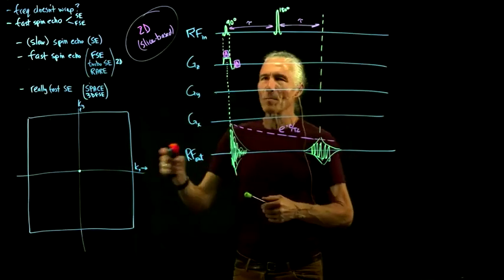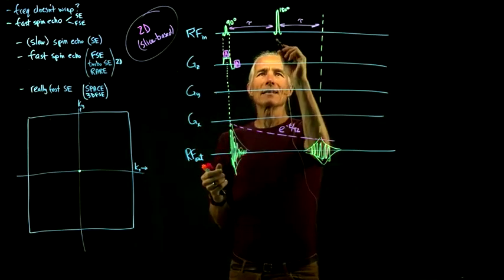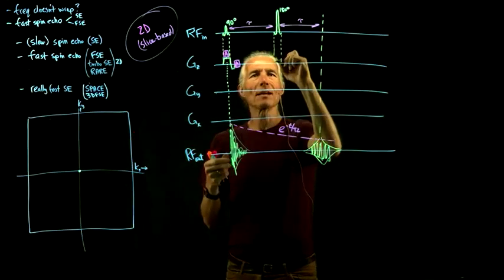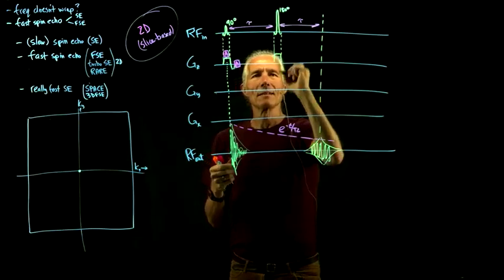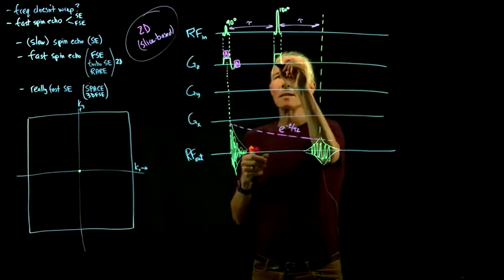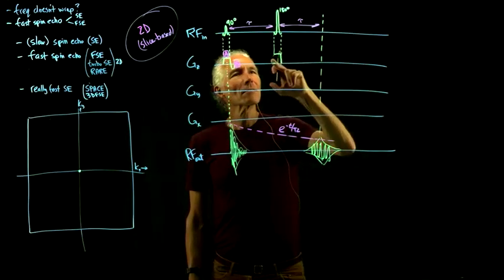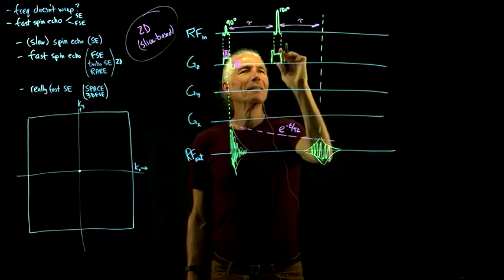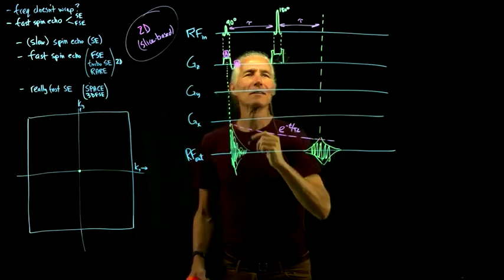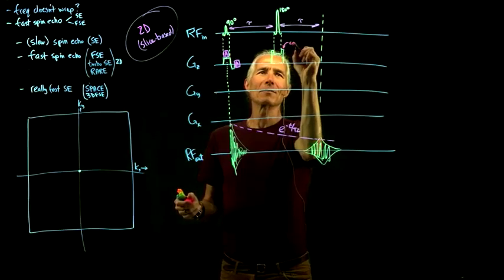There's a couple other things going on before we go back to k-space. When we do the RF pulse here, we've got to do a slice select for this too, because if we're just doing a slice and we want to do some other slices at some other time, we need to actually have the slice select gradient on, and this 180 pulse has to be a frequency specific RF pulse, so it will just excite spins in that little slab. But now if you ever look at any pulse sequences, you'll see there's always some ears on the pulse sequence like that. One of the little ears on there. And these little ears are the crushers. So you always have those on there, and so why?